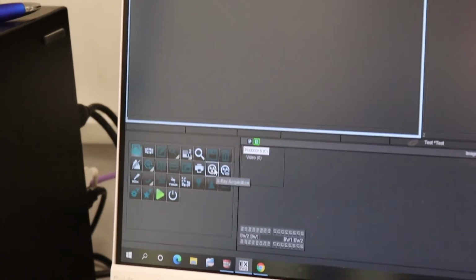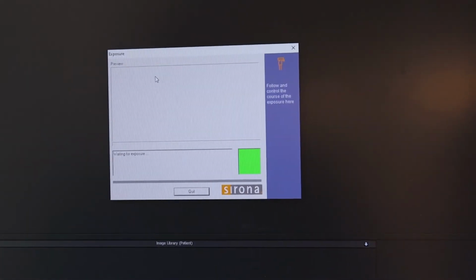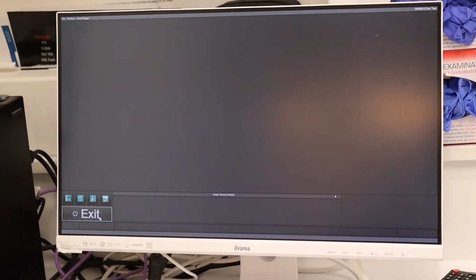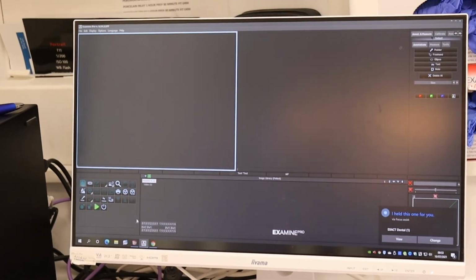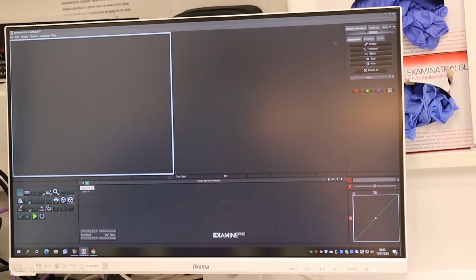The OPT machine is selected by selecting this icon, and then you select the icon which looks like the OPT. You then get this which says ready for exposure. You should then stand at the doorway of the surgery, and the dentist will take the patient down to the X-ray room. As the exposure is happening, you can communicate that the image is being captured on the computer. This is a key task, so the dentist knows that the image is getting captured. Once you come back, you can close that and label it.